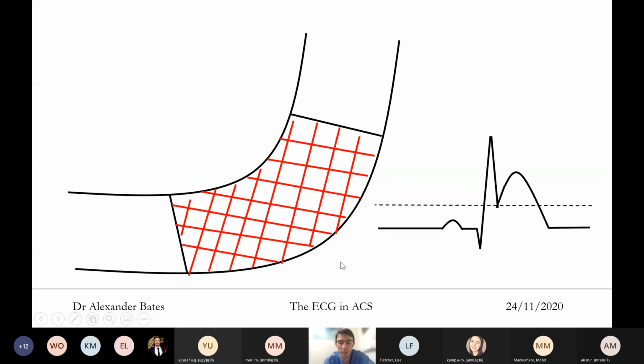If you take this, which is a transmural ST elevation infarct, then if you have an electrode right here, right where the infarct is occurring, you detect minimal electrical activity, and the only electrical activity you can find from here is going away from the heart. So if you think something's going away, your isoelectric line will go down. It'll be much lower than normal.